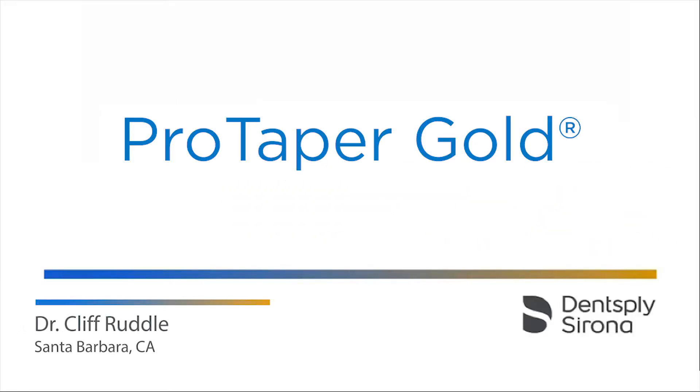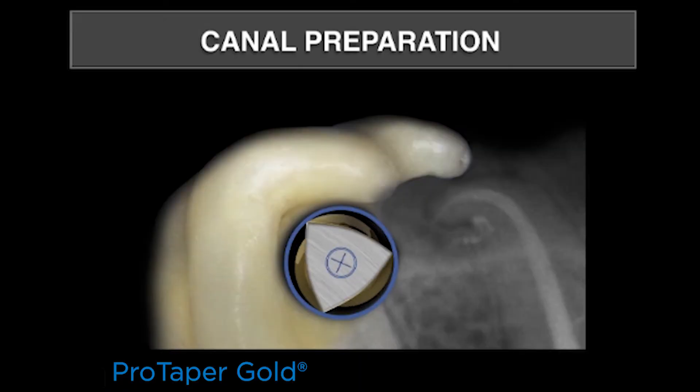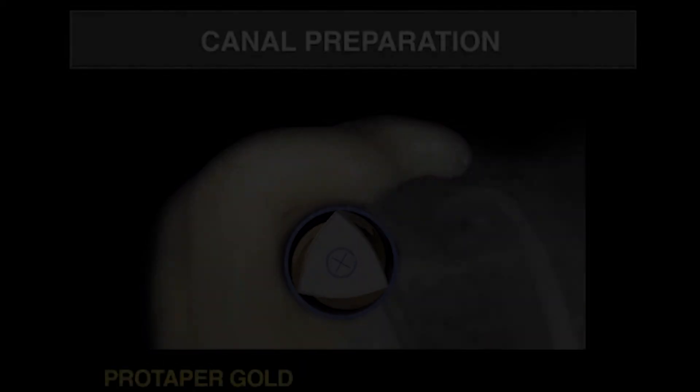Let's talk about canal preparation featuring ProTaper Gold. It's important to know that ProTaper Gold has exactly the same geometries as its predecessor ProTaper Universal, with a convex triangular cross-section and a centered mass of rotation. Let's take a look.